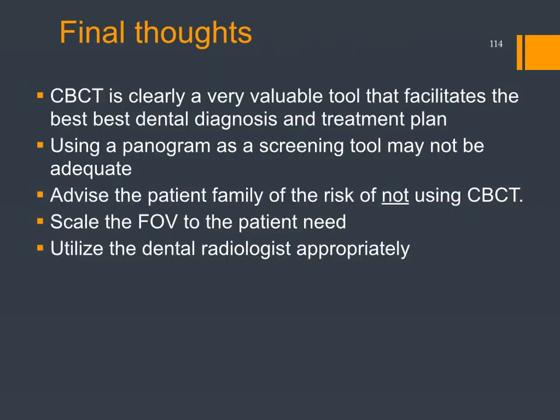So just to wind this up, I do believe that 3D x-rays are very valuable. It helps us make a better diagnosis and treatment plan in so many cases. I do believe that using the panogram as a screening tool is just probably not adequate. I don't really think it's a good choice. I do advise the family of the risk of not using a 3D x-ray, and then we scale the field of view and the power according to how we see the patient's need. And then we use the dental radiologist as we need to. I'd say about 30% of our cases we send the films off to the radiologist for reports.